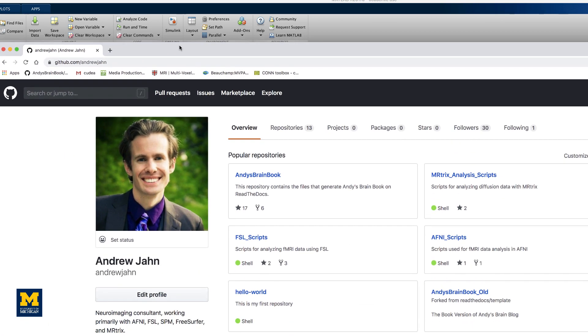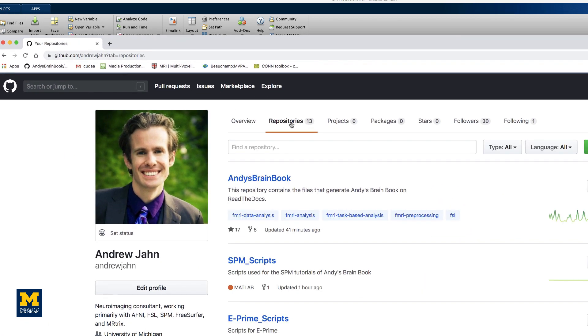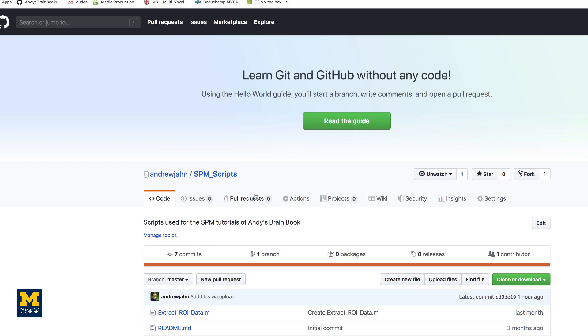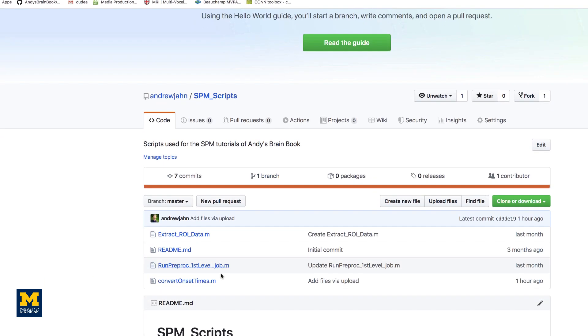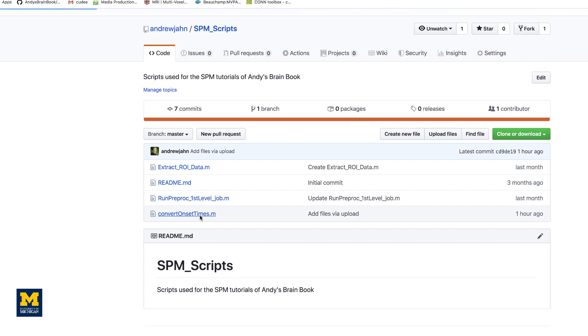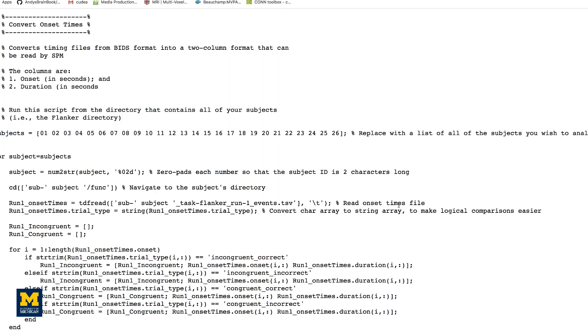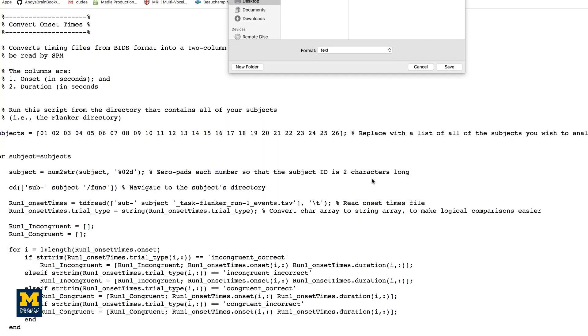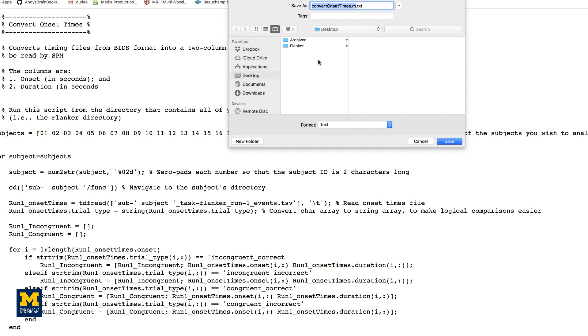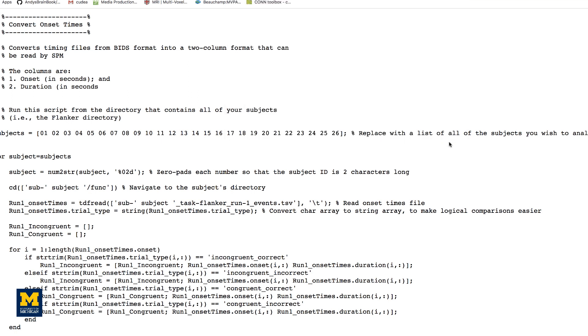First, go to the website github.com/andrewjahn, click on the SPMScripts repository, and click on Convert Onset Times. Click on Raw and then right-click and save the file into the Flanker directory, making sure to remove the .txt extension.